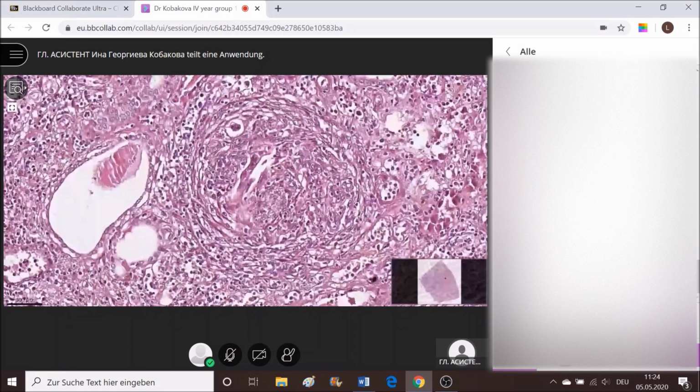Lots of immune cells. Not exactly. I see proliferation of cells, but are these cells immune? Yeah, some fibrous depositions could be observed in the form of fiber strands. Also, what else? Which are the cells to have suffered proliferation? Hyaline, not exactly. Maybe here in a single position, but not. That should be an amorphous substance. This one is not amorphous.